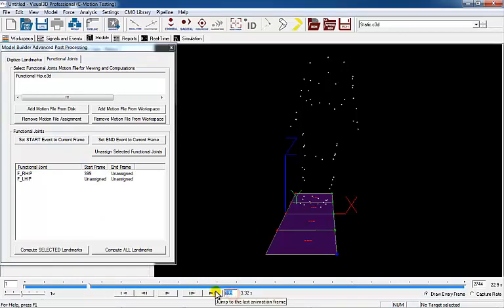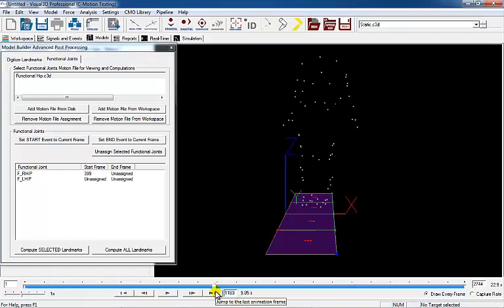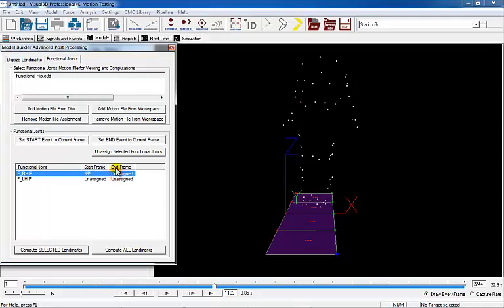Select the end of the right functional hip motion by going to frame 1183, selecting FR hip, and click Set End Event to Current Frame.